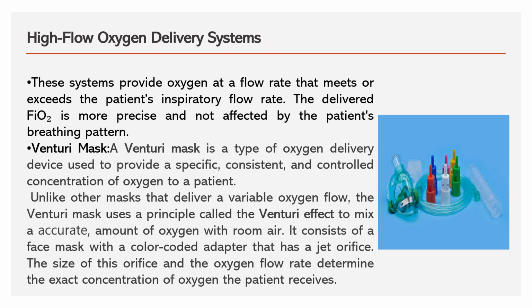We were looking at low flow oxygen delivery systems up to now. Now let's see high flow oxygen delivery systems. In this system, oxygen is provided in a high flow concentration. FiO2 will be delivered high. The first equipment is the Venturi mask.